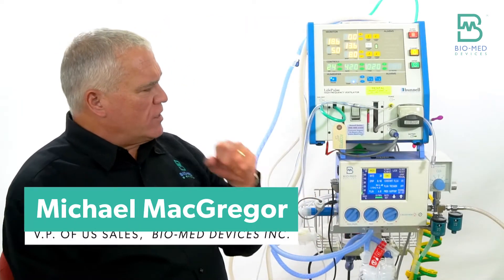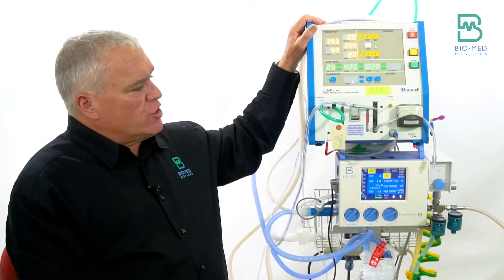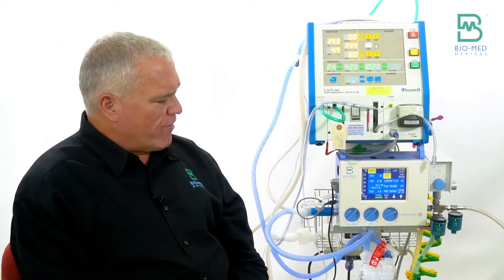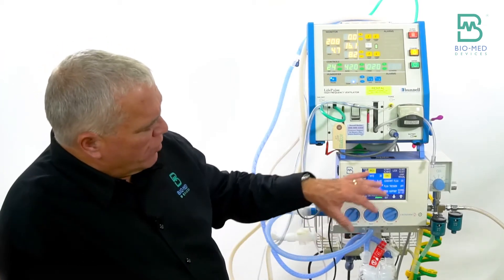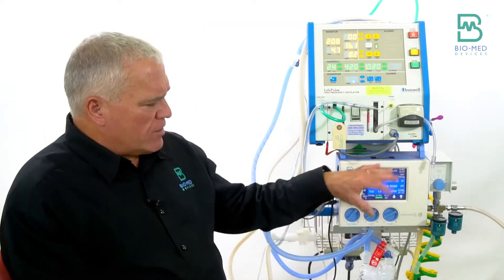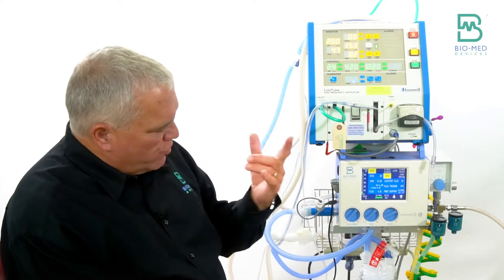As far as setting up the Cross Vent to use with the jet, there are a couple of nuances you have to be aware of. This is pretty much true with any vent you use with the jet — that high-frequency jet ventilation at a rate of 420 breaths per minute plays havoc — but the Cross Vent actually does work better than most as far as alarms and that kind of thing.